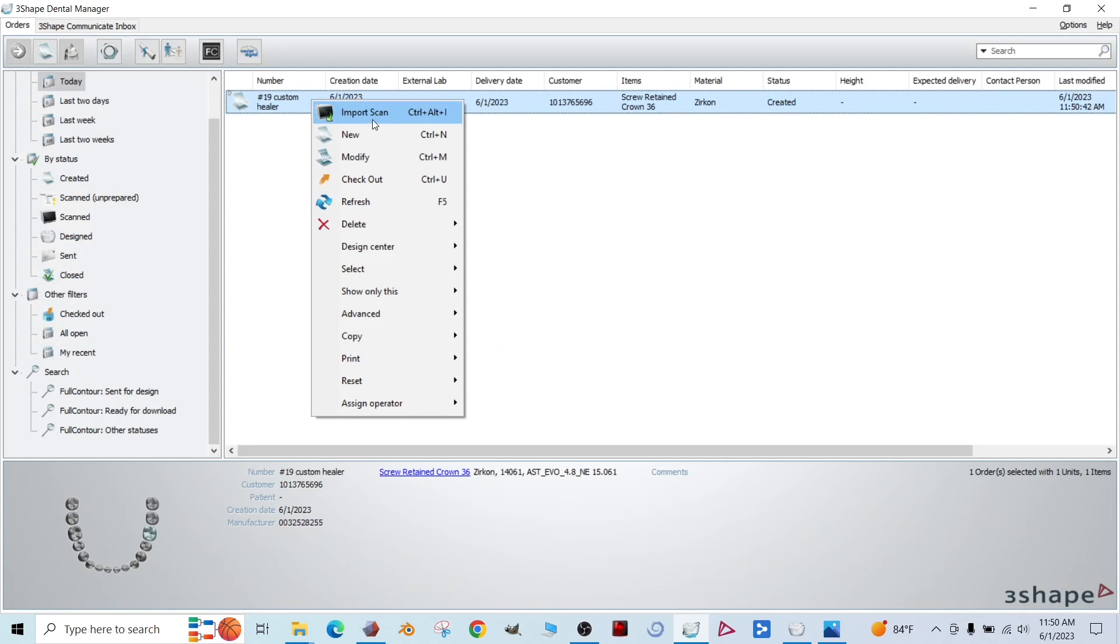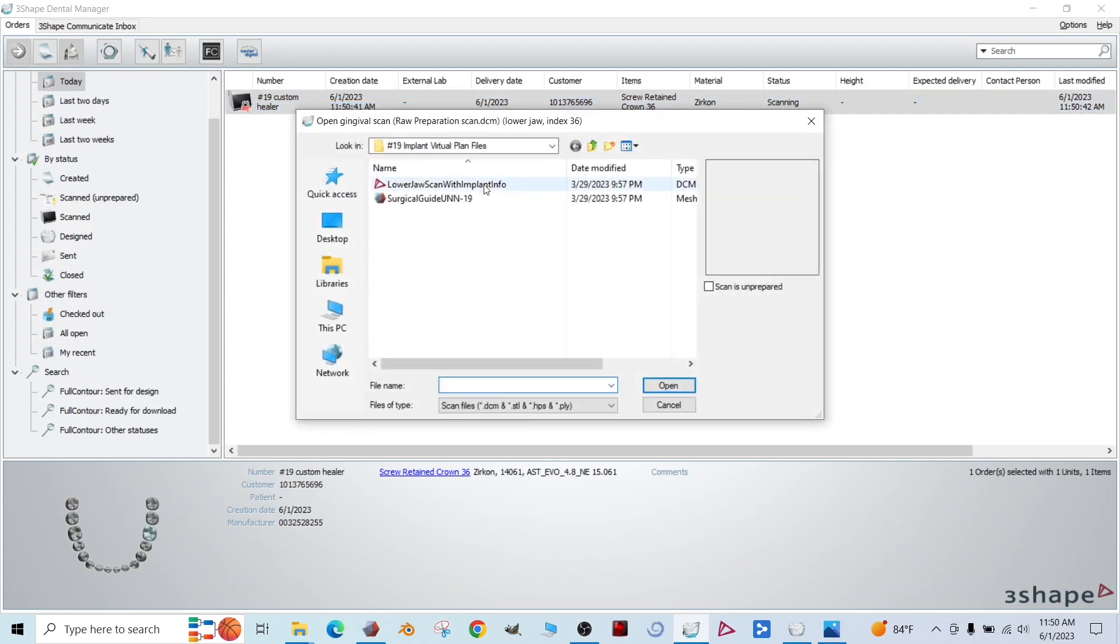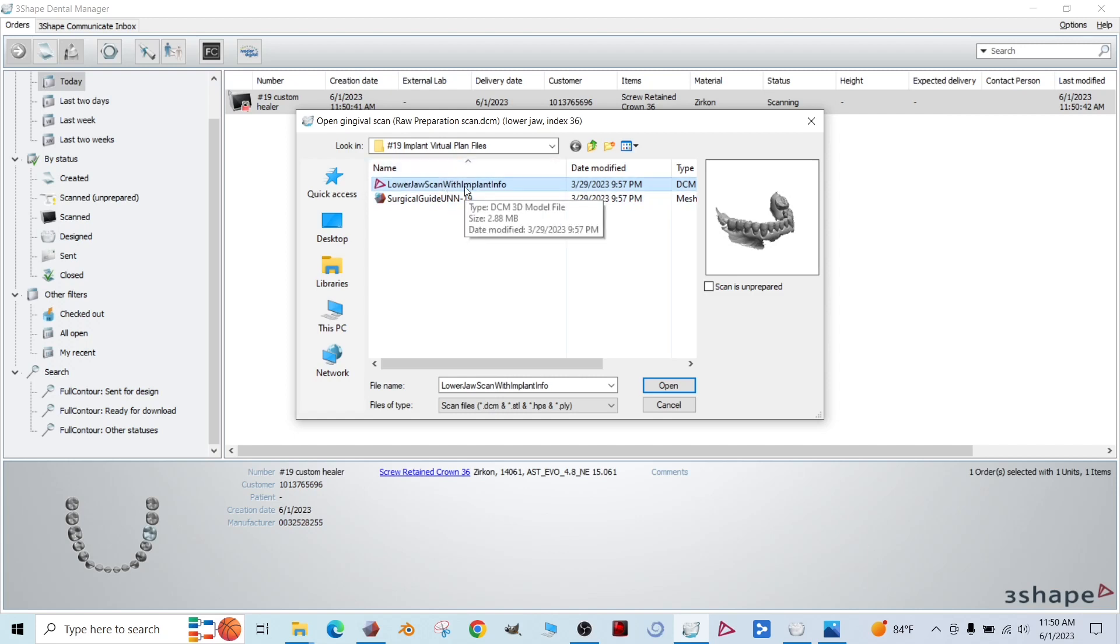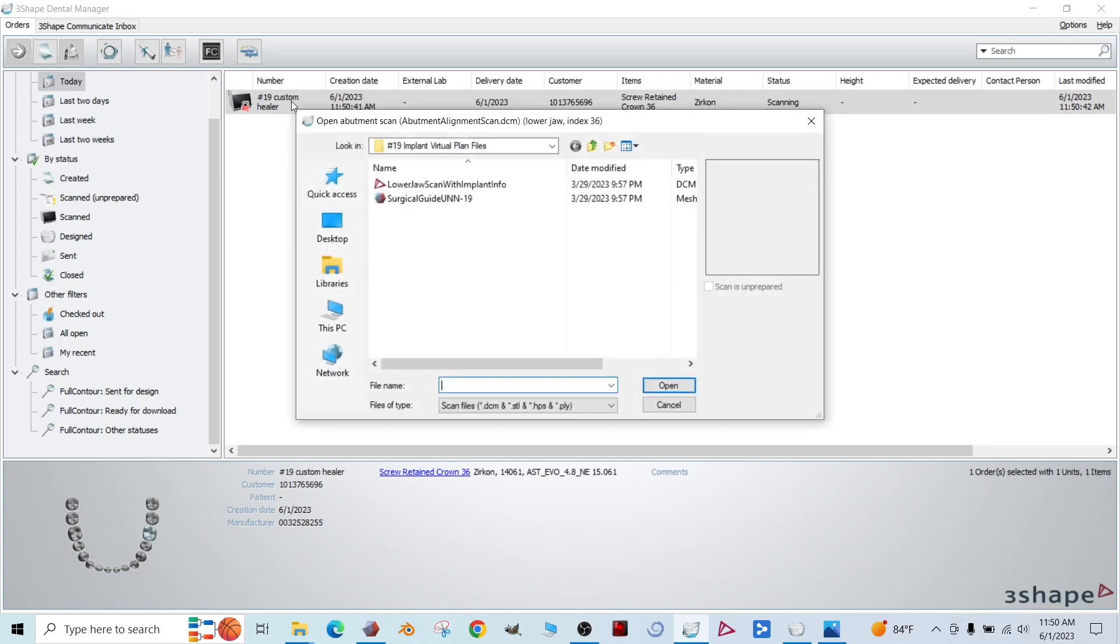Now you're going to right click the case, import the scan. Here's our lower jaw scan with implant info. Again, that's our intraoral scan plus our virtual implant from our treatment plan.